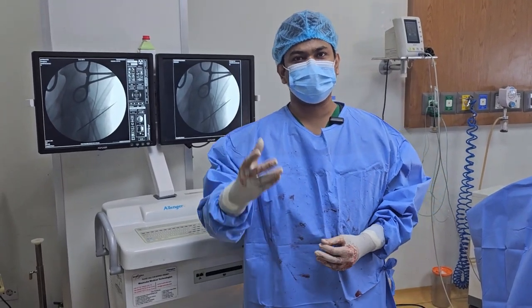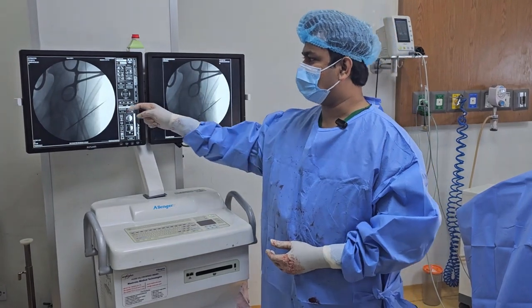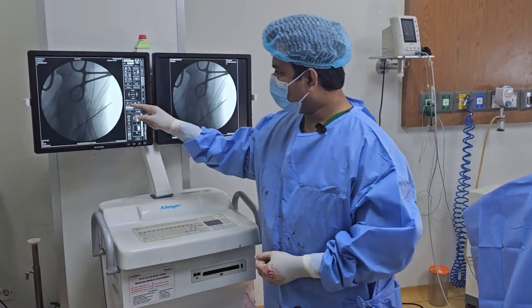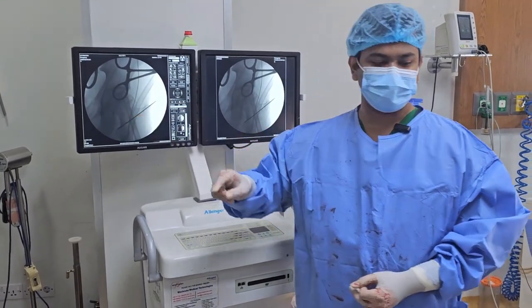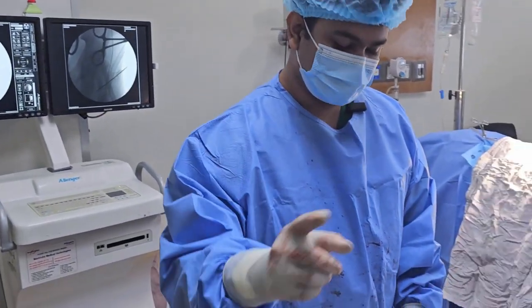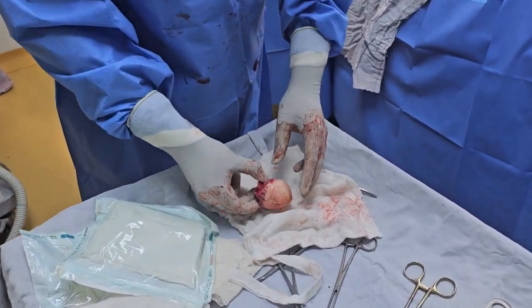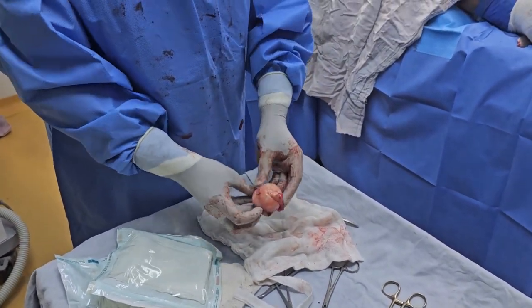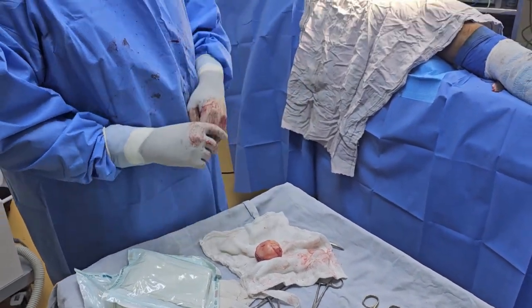This is the pre-operative templating. This is the fluoroscopy that we use. This is the marking of the material. This is the ball — the artificial ball used in the replacement.